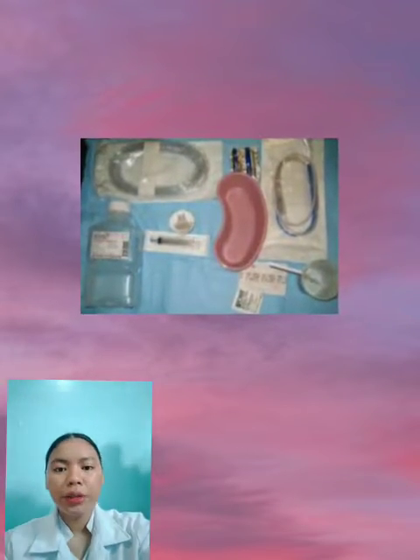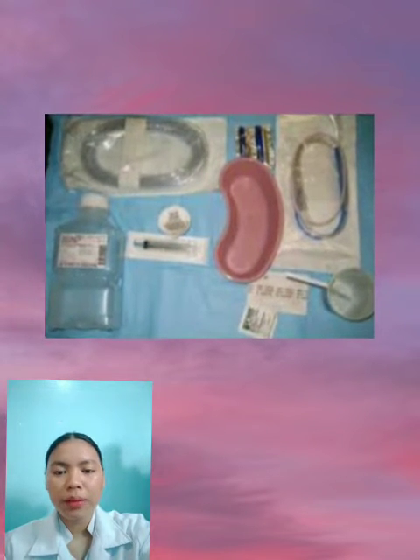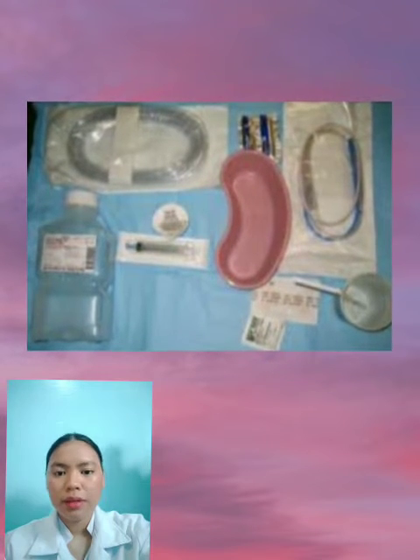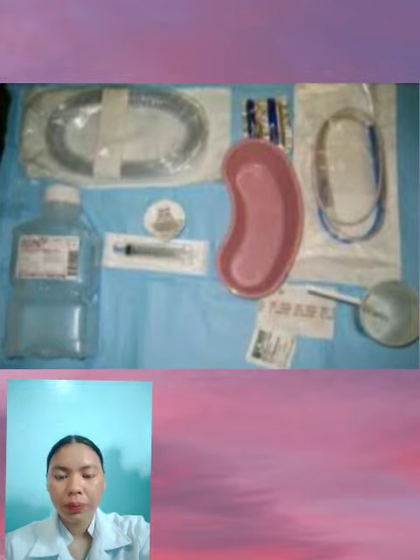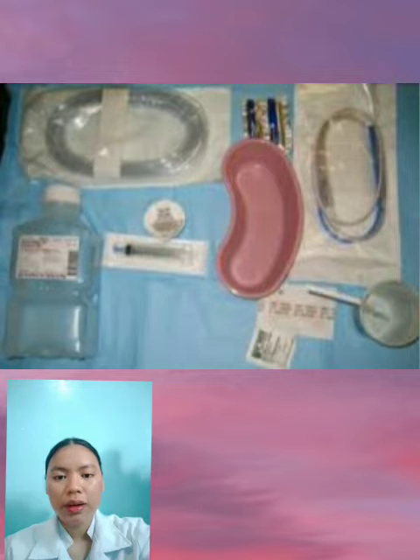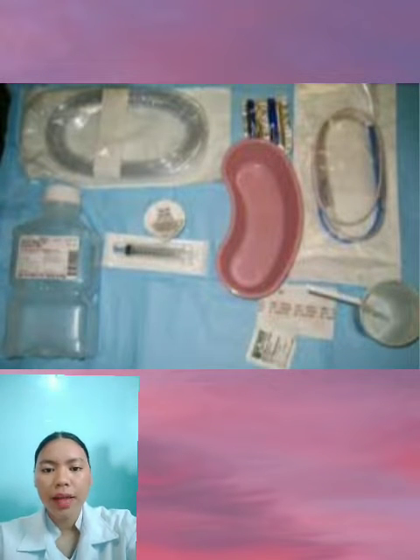For the equipment: large or small bore tube, non-latex, prepared. Non-allergenic adhesive tape 2.5 cm or 1 inch wide. Clean gloves, water-soluble lubricant, facial tissues, glass of water and drinking straw. 20 to 50 ml syringe with an adapter, basin, pH test strip or meter if available, bilirubin dipstick, stethoscope, disposable pad or towel, clamp or plug optional. Anti-reflux valve for air vent if sump tube is used, suction apparatus, safety pin and elastic band, CO2 detector optional.